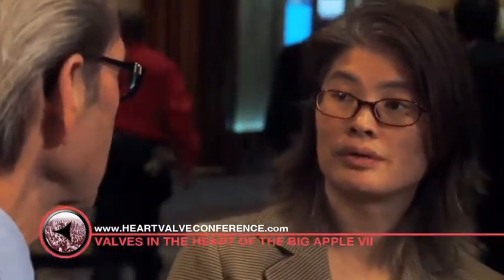Let me challenge you. I'm going to cut in. It's simply because I get challenged all the time, and it's obvious that all the literature is CT, which may be right, looking at not only shape and size, but calcification, things like that. Will we get to the place, or you may be at Mayo, or maybe you are at Mass General, where the guys feel that you're accurate enough for annular size? I think we are, absolutely. Really? Yeah, I think when we do our TAVRs, we use 3D guided assessment of the annulus.